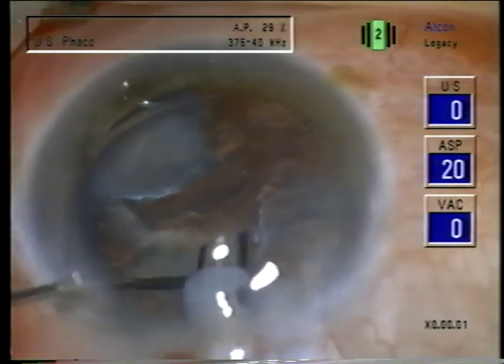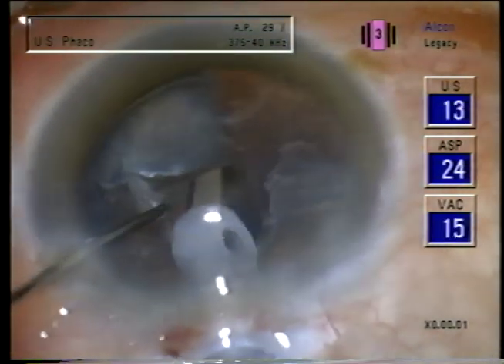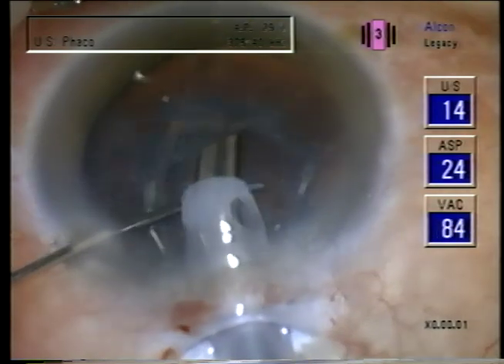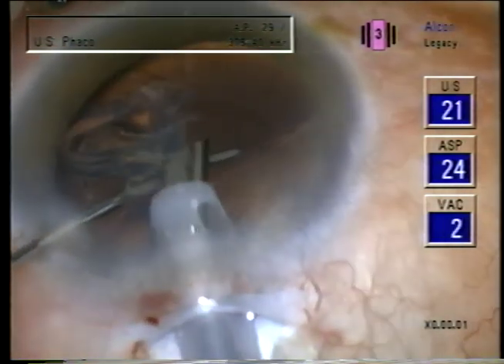But it does allow more stability in delicate situations if the segments are left in place. Now with the epinucleus well loosened, it also comes easily without any struggle.